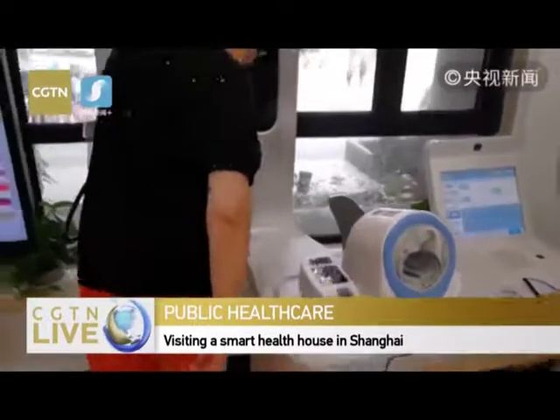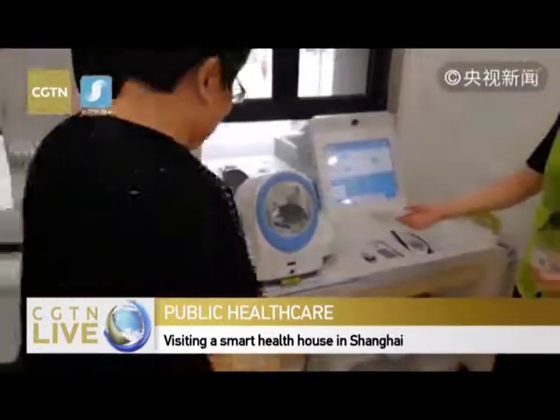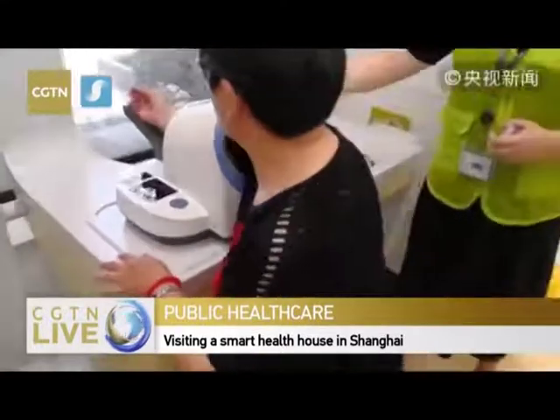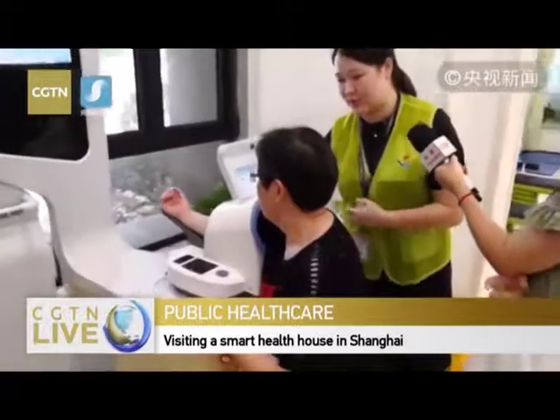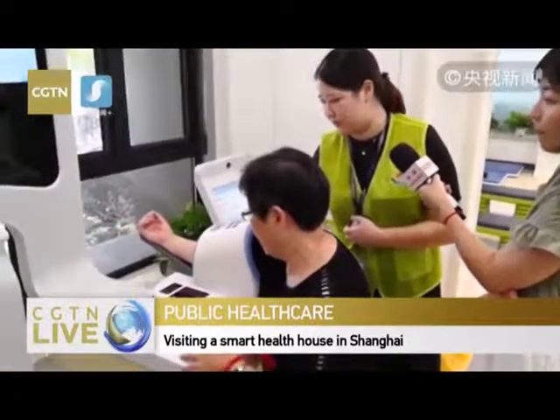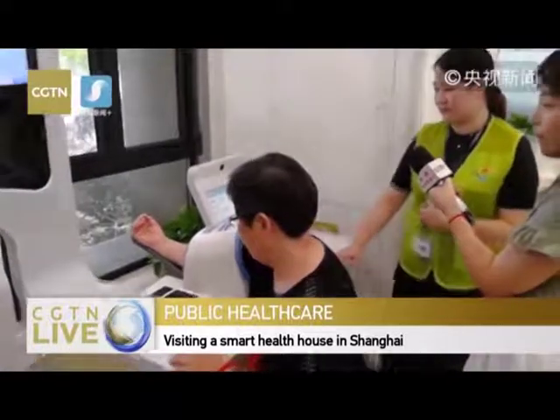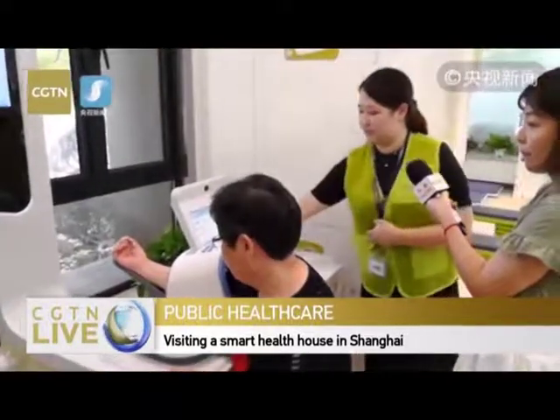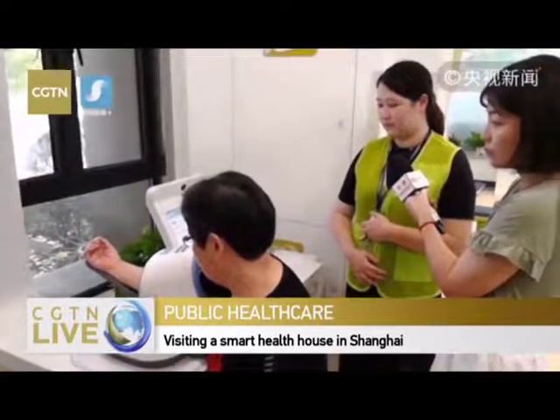We can also test the blood pressure. When you're testing the blood pressure, you're not allowed to speak, because that will cause your number to fluctuate.